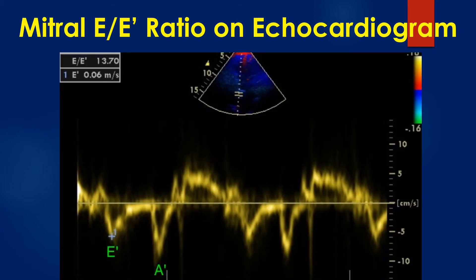The software usually gives the E by E prime ratio automatically. In this case, the ratio is given as 13.7.